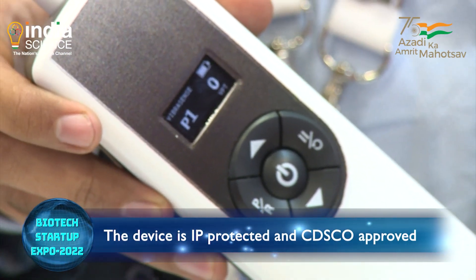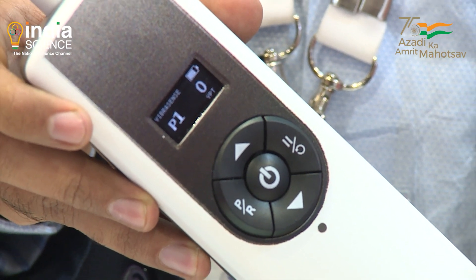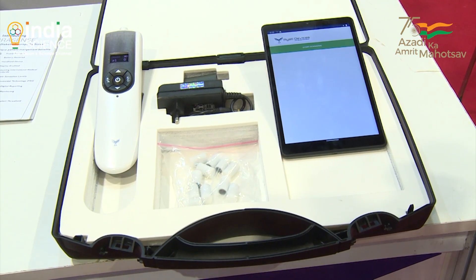Now we have marketed the device and doctors are really interested in it. The device is patented and CE approved. We are looking forward to distribution in many countries as well.